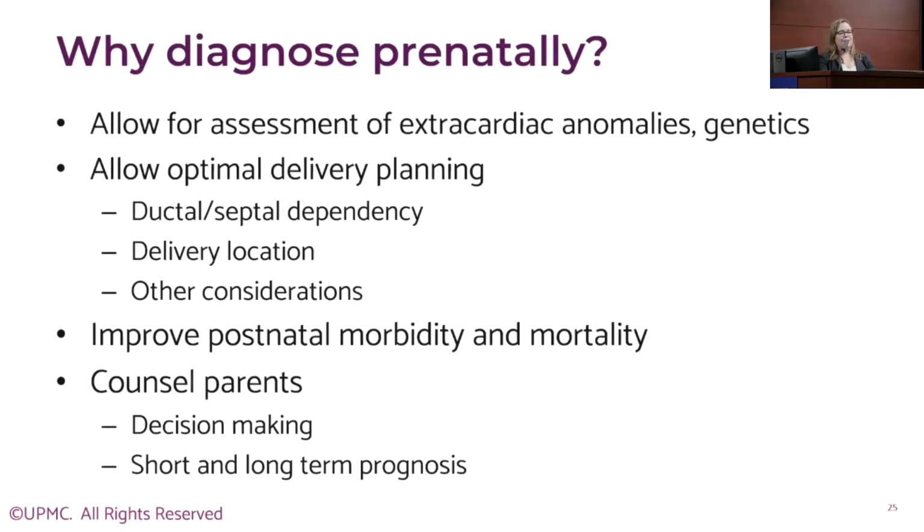So in looking at these pretty pictures of fetal univentricular hearts, it's important to remember why this is important. The assessment of these congenital heart lesions in fetal life allows for us to determine an accurate diagnosis especially for delivery planning and the care of these babies in the immediate postnatal period to get them to the right delivery location and with the right support that they need. And all in an effort to improve postnatal morbidity and mortality.